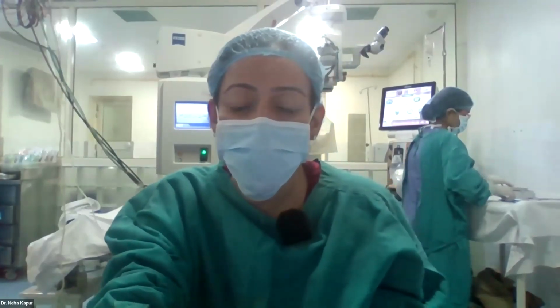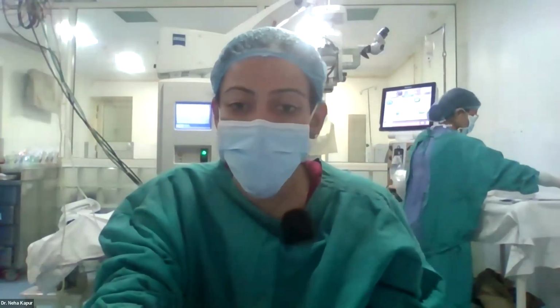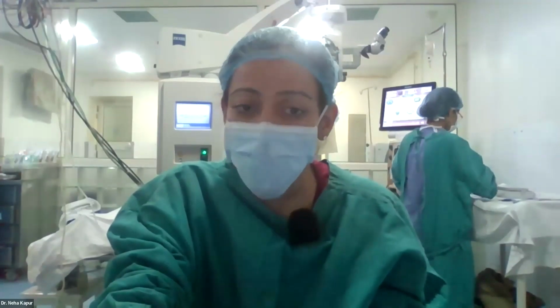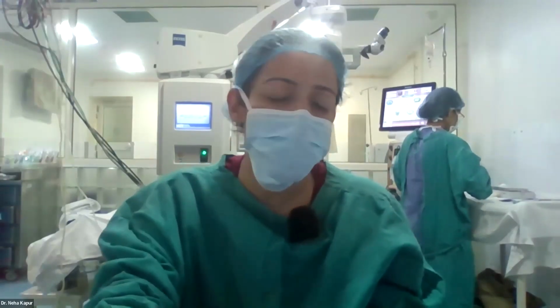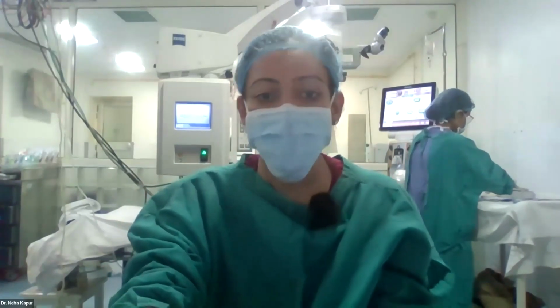Any chance of glaucoma and cataract after this procedure? The patient is already pseudophakic, so no. But if you were dealing with a phakic patient, yes, there could be. And chance of glaucoma, if you've kept a mobile bubble, then no, we don't expect trouble with the pressure.